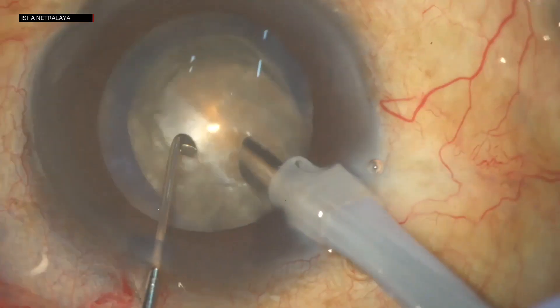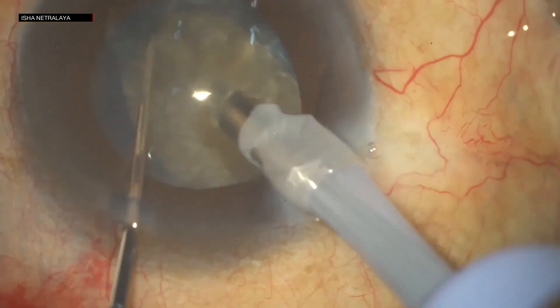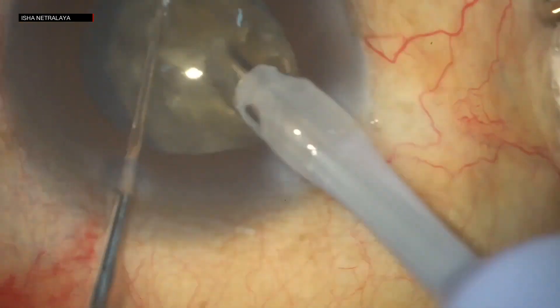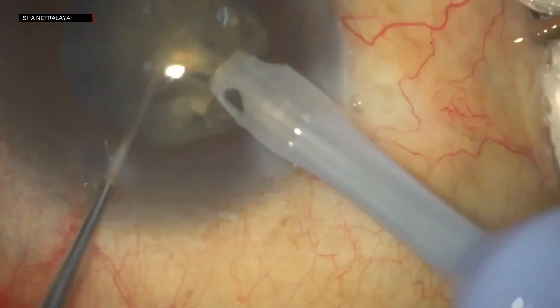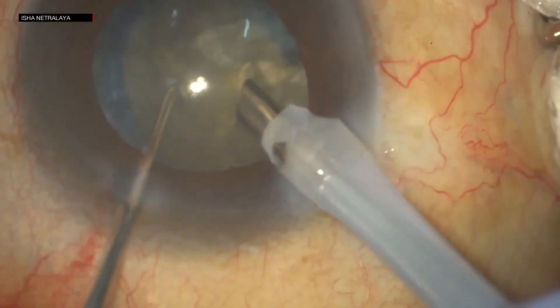Phacoemulsification was started with a good direct chop. However, the tear extended posteriorly and resulted in a nucleus drop.